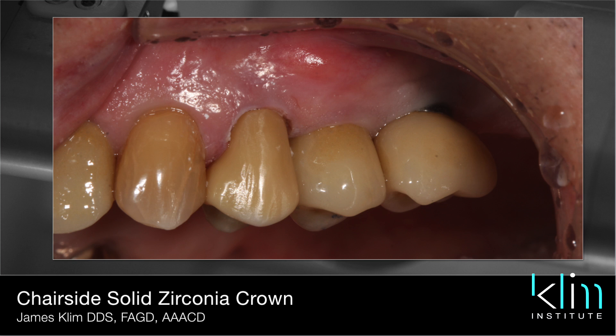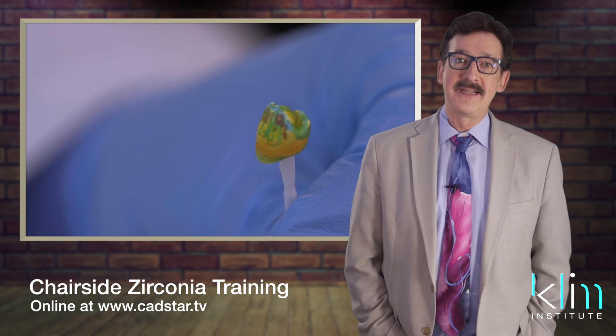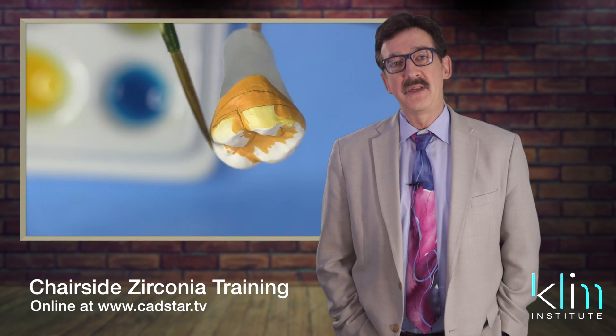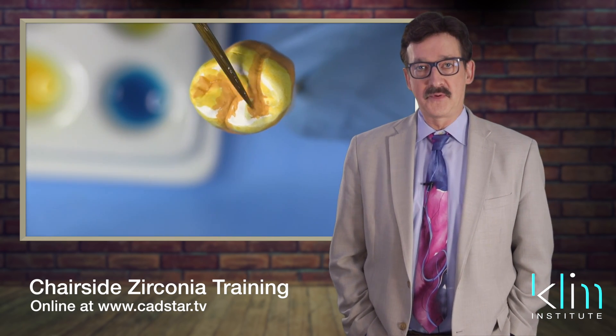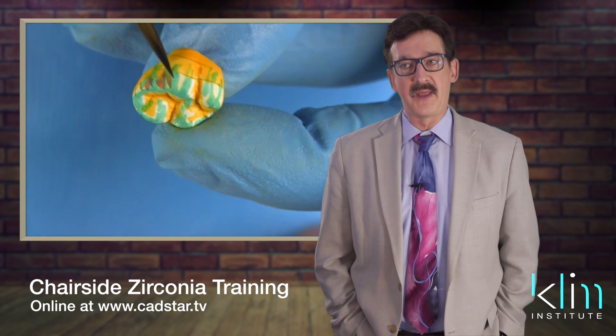You'll have to experiment with this for a while. What really controls the saturation and the color effects within the pre-coloring infiltration technique is how many coats you place on, and you're just going to have to get a feel for that.